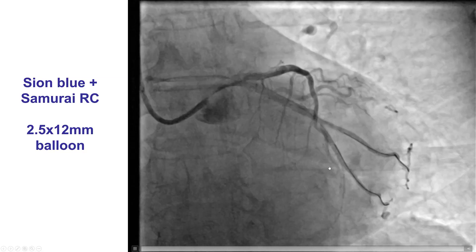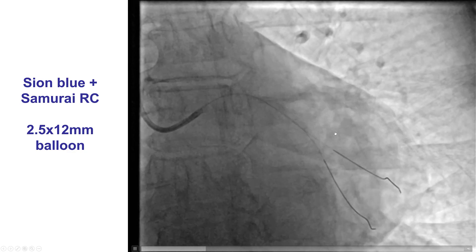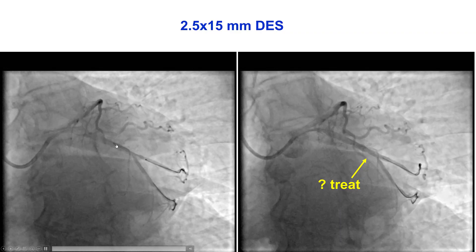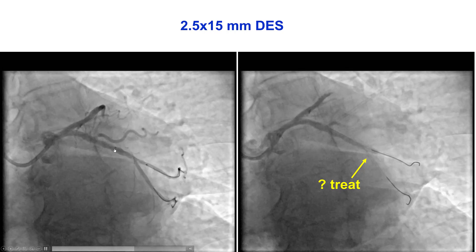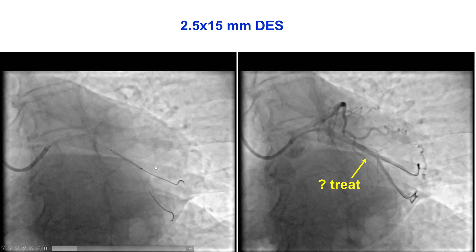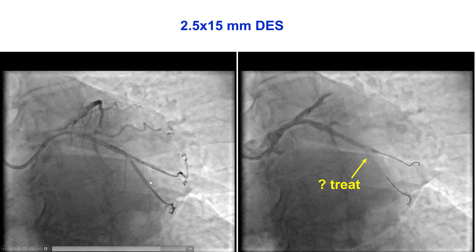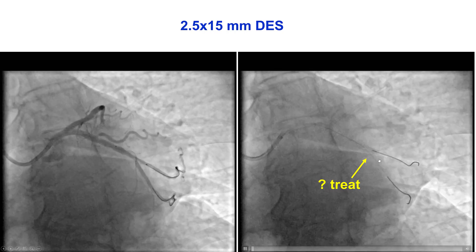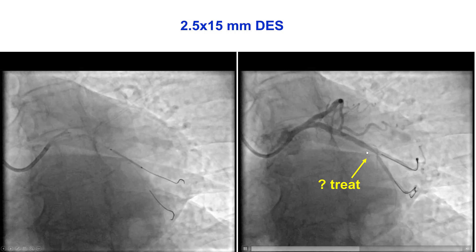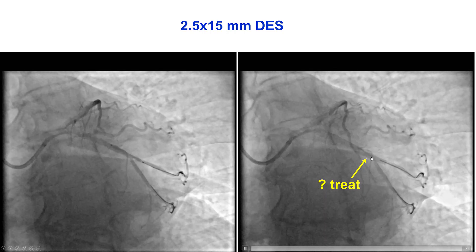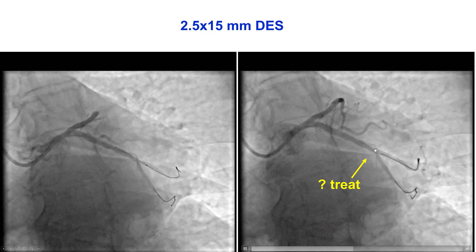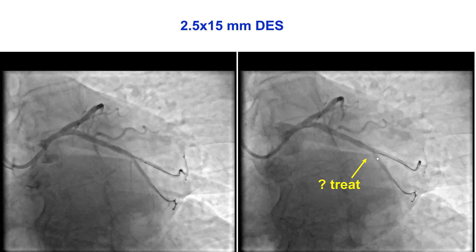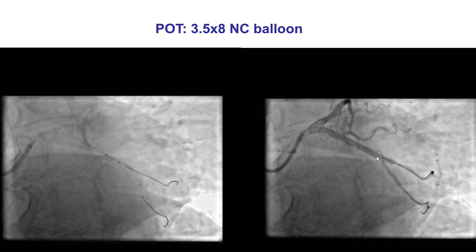We wired both branches with workhorse guide wires, pre-dilated the lesion, and then did provisional stenting — stenting from the proximal portion of the main vessel to the superior branch, jailing the inferior branch. After the stent is deployed, there is a little pinching of the inferior branch origin, and the question is whether this is significant. If it is, something more may need to be done; if not, it may be close to being done.